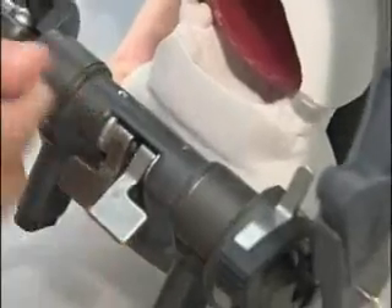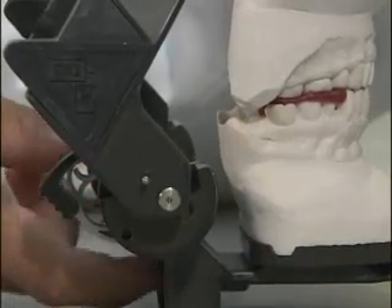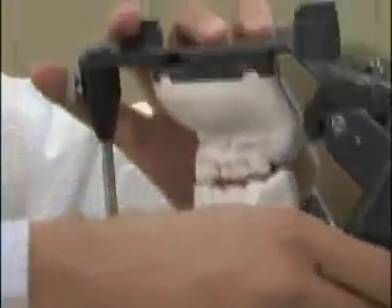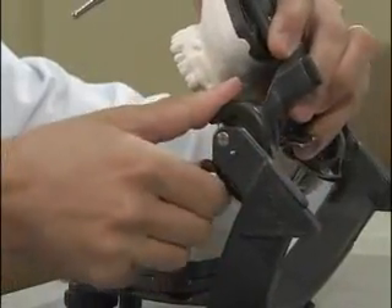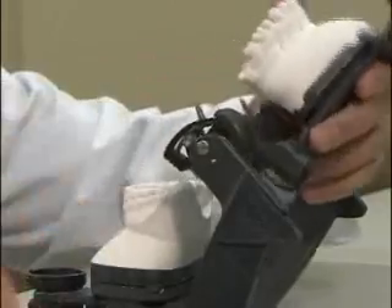Repeat the same process for the opposite side. Now flip your articulator over and re-lock your centric latches after opening the articulator. Now that we've utilized the protrusive record, that's gotten us in the ballpark for setting our condylar inclination.